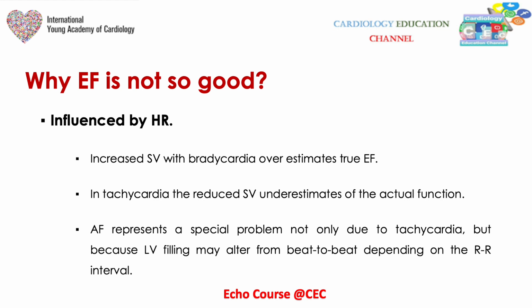Also, the ejection fraction is influenced by the heart rate, as increased stroke volume with bradycardia overestimates the true ejection fraction, and in tachycardia the reduced stroke volume underestimates the actual function. Patients with atrial fibrillation represent a special problem, not only due to tachycardia, but because LV filling may alter from beat to beat depending on the RR interval.